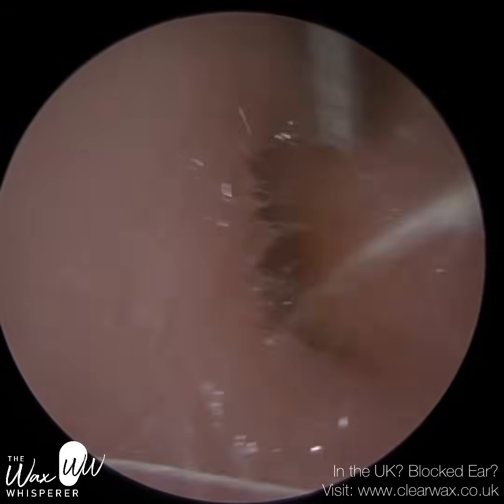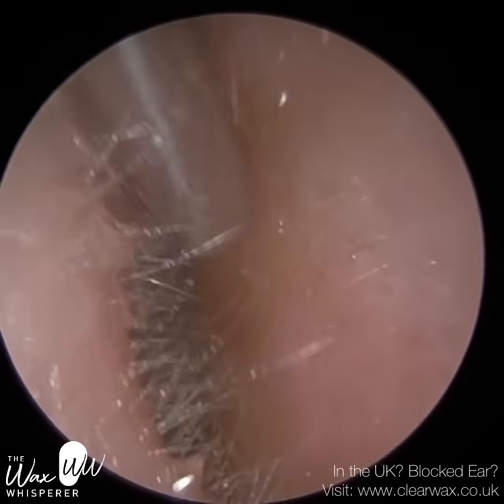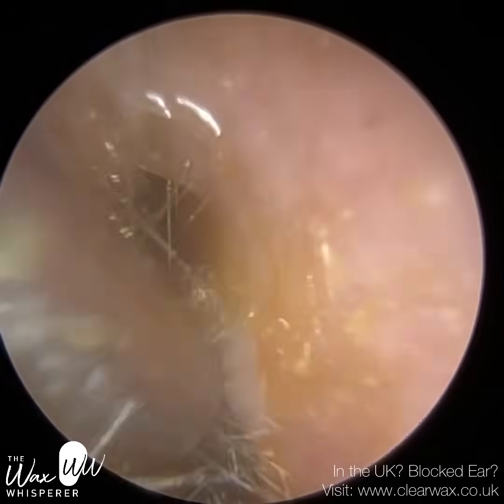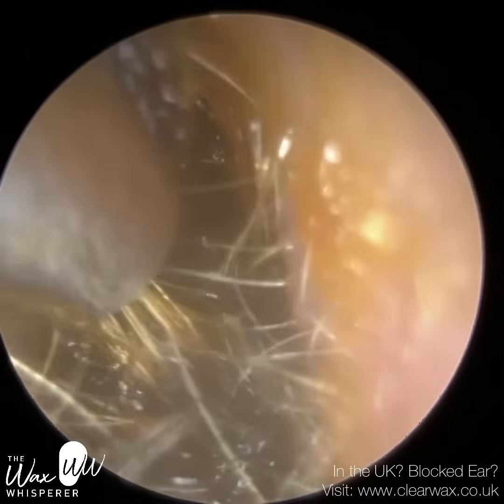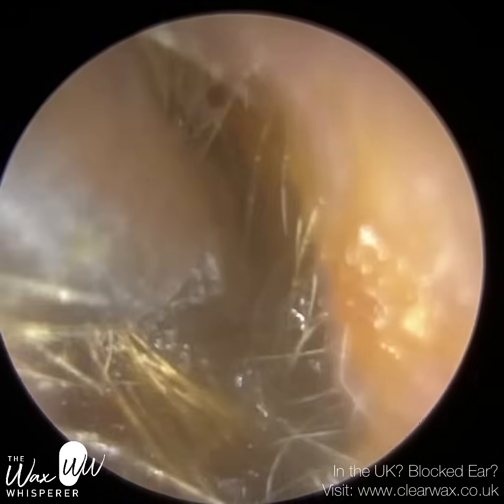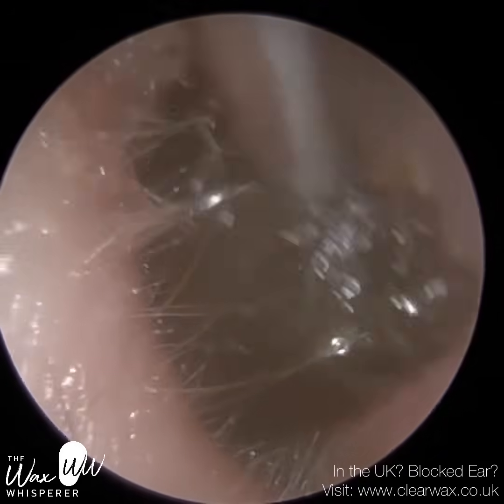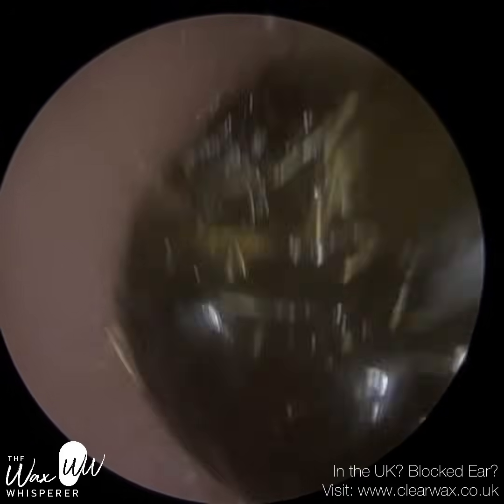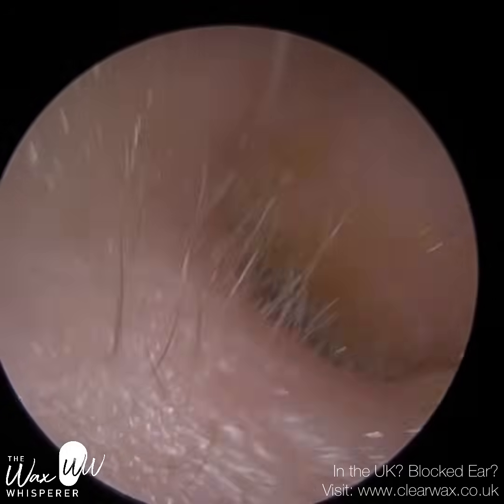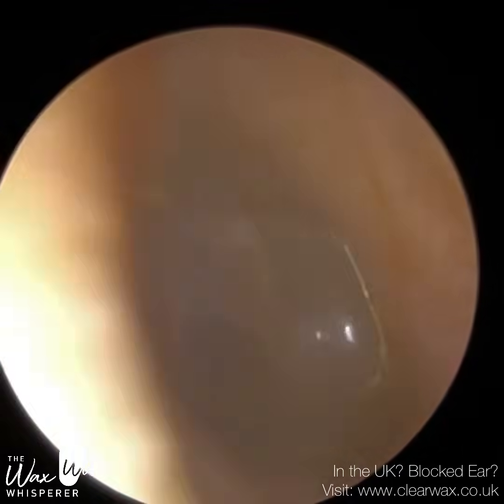The key here is I don't want to be too aggressive — I don't want to overwork the sucker, because if I do, I will just break the wax into little pieces, and I'm trying to bring this out in one single piece. Again, you can see all the hairs that are matted against this wax. I'm just going to the roof and bringing this down and up and away. And we're nearly there — there we are. I managed to remove that in a single piece. I'm just going to re-enter — that's the patient's eardrum, nice and healthy.